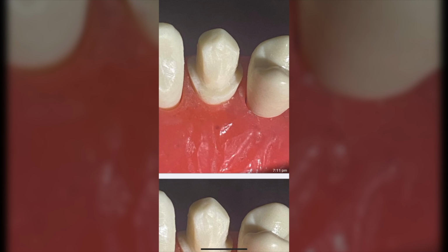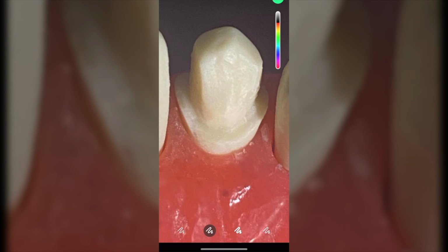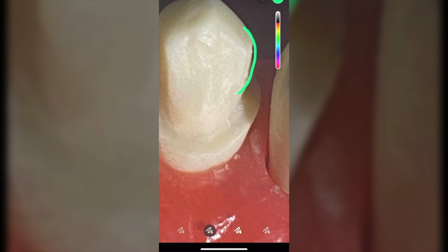All right, look at the crown prep. What's the first thing you notice? It's thicker on the top and thinner on the bottom. What does this suggest to you? This suggests there's a clear undercut. What's the definition of an undercut? The area below the maximum convexity is the true definition of an undercut, right? Maximum convexity, and then that's your undercut right there.